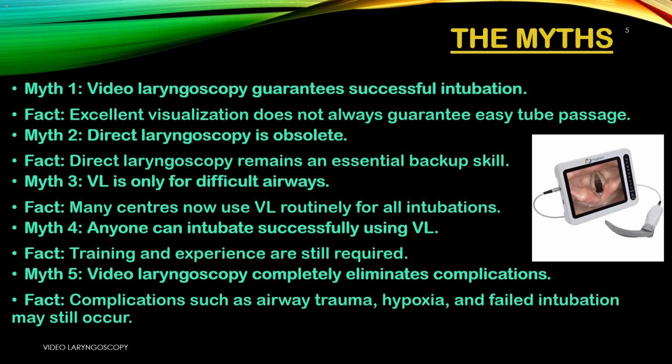3. Myth: VL is only for difficult airways. Fact: Many centers now use VL routinely for all intubations. 4. Myth: Anyone can intubate successfully using VL. Fact: Training and experience are still required. 5. Myth: Video laryngoscopy completely eliminates complications. Fact: Complications such as airway trauma, hypoxia, and failed intubation may still occur. Know the tool. Respect the skill.